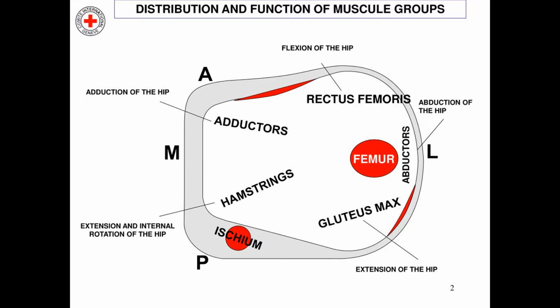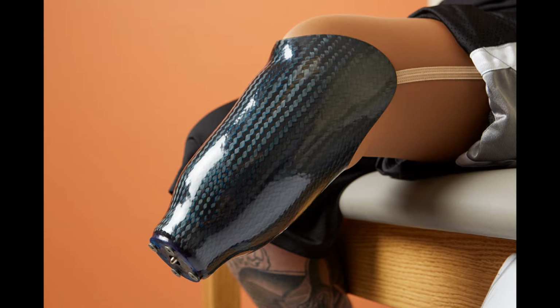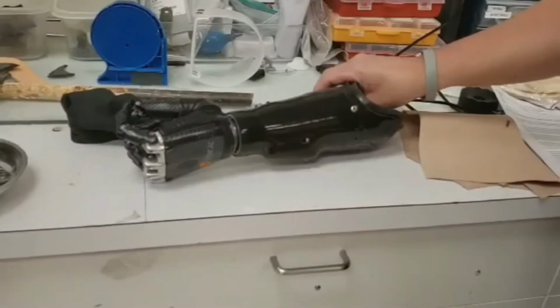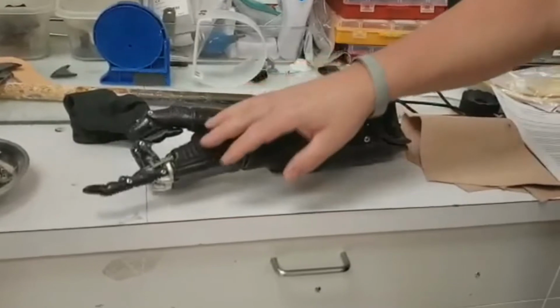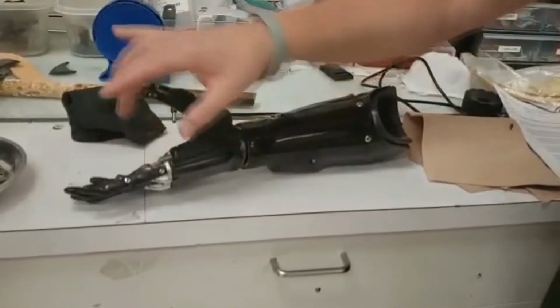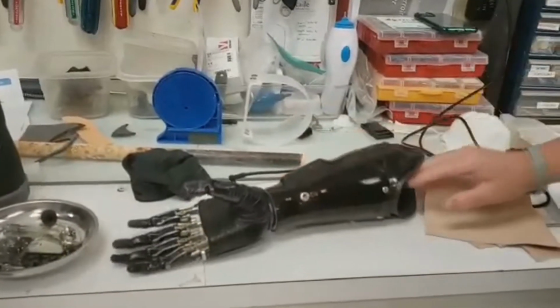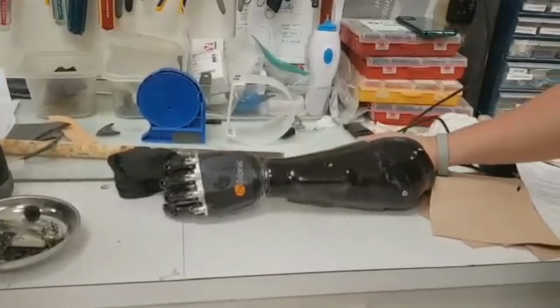The quadrilateral socket developed in the 1950s and the ischial containment socket developed in the 1980s are some socket types that are still used to this day for transfemoral amputees. Recent advancements include using modern plastics and carbon fibers to make the prostheses as lightweight and durable as possible. Additionally, modern casting and shape tracing techniques increase the user's comfort level by enabling the creation of custom sockets. As well, the implementation of electronics in the form of myoelectric devices and microprocessor controller knees marks some of the most current prosthetic technology. Unfortunately, these devices are still uncommon due to their expensive manufacturing process.